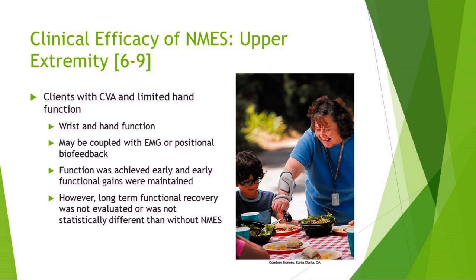A lot of the studies in terms of clinical efficacy show there are other treatments besides these electrical stim devices that help them return to function. Either they didn't evaluate the long-term recovery in the studies, or it wasn't statistically different from traditional therapy without NMES. So it's just another option out there for treatment.